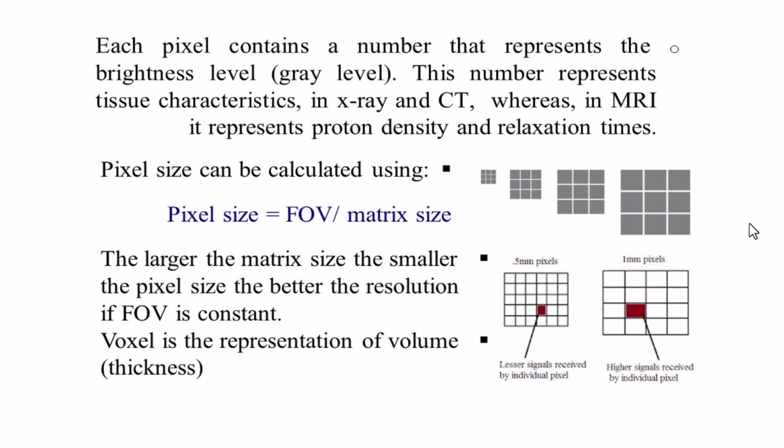Don't worry, you won't have to remember this for the registry. We're going to be focusing on X-ray content. In all cases, these are just forms of electromagnetic radiation being measured.